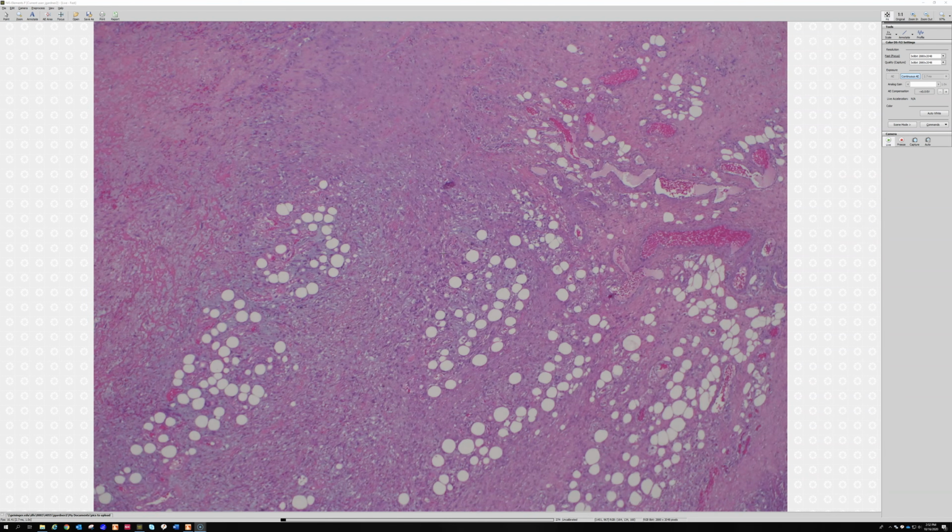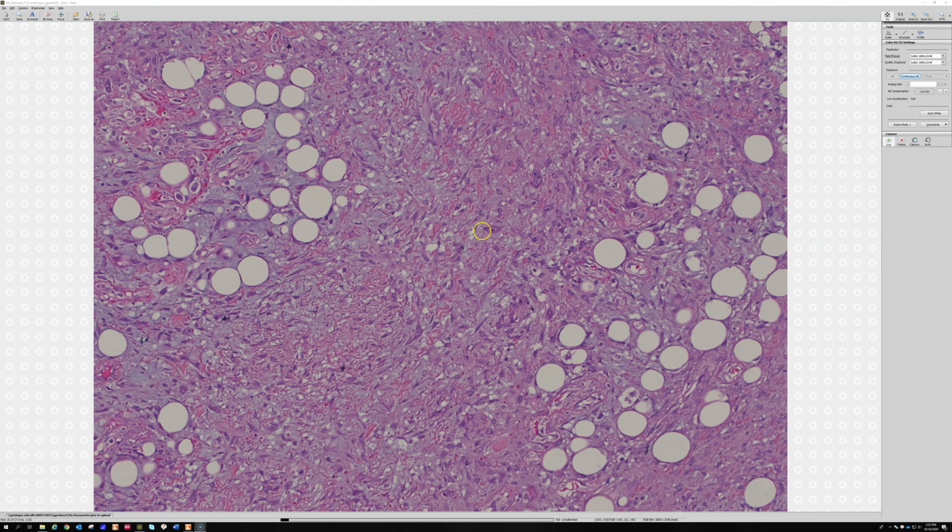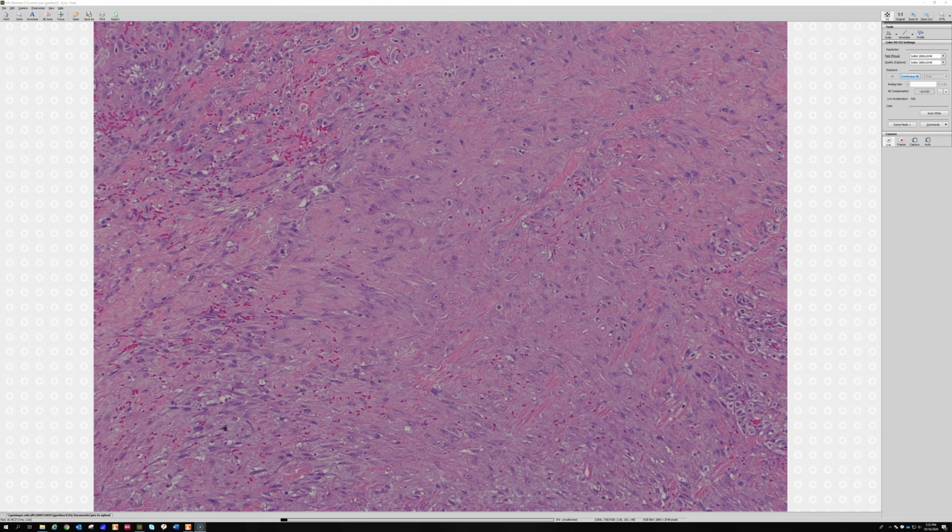And it sometimes has ganglion-like cells, just like you can see in proliferative myositis, proliferative fasciitis. There they are right there. Those are the ganglion-like cells again. And the fat is just kind of caught up in the middle of it.